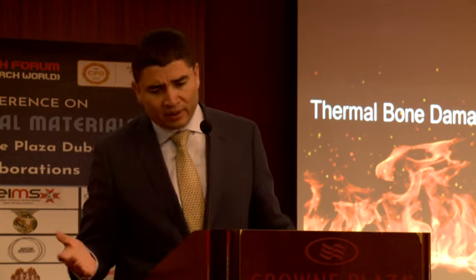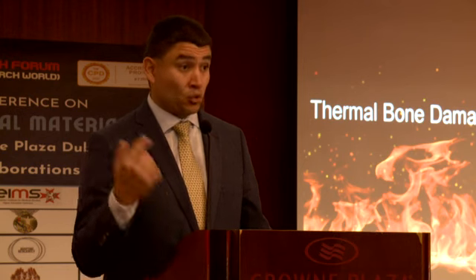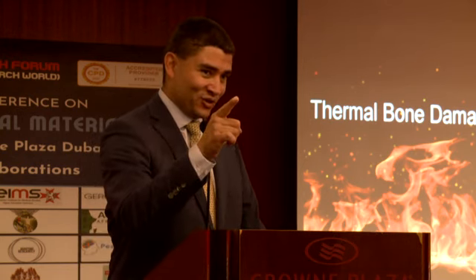Oh, doc, I drill at a low speed, and I only drill in patients with type 4 bone. I don't drill anybody else. I don't generate that much heat, and I use water. And I use internal irrigation too.